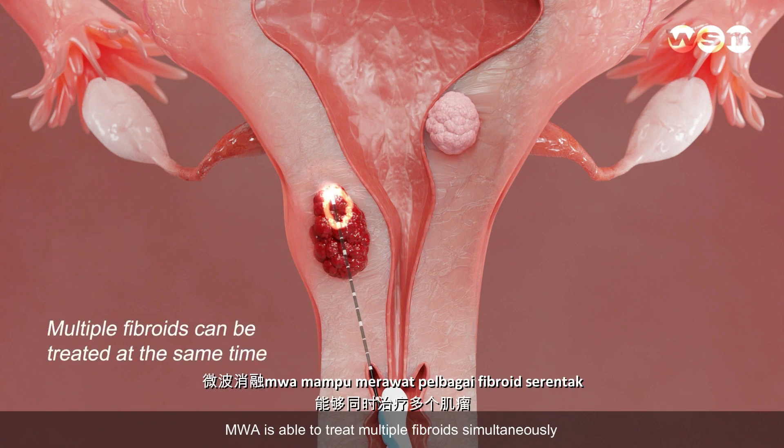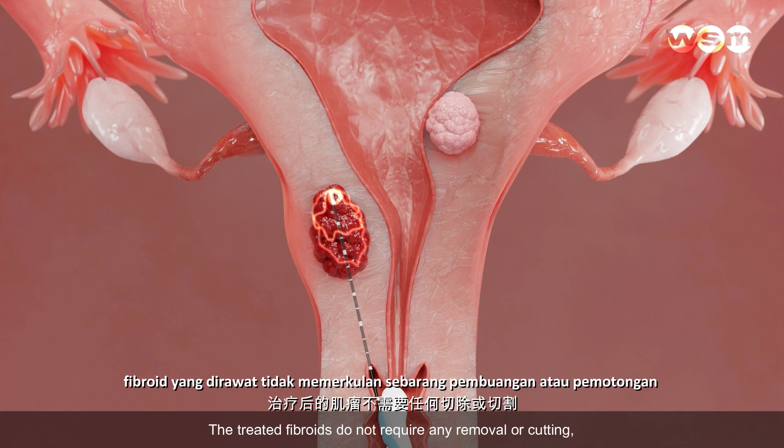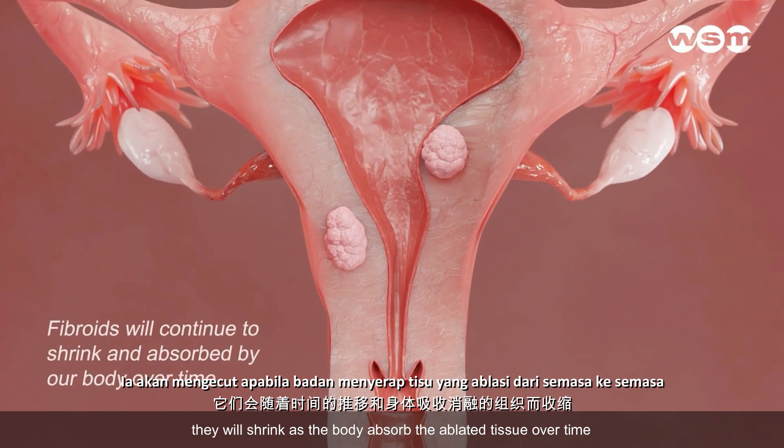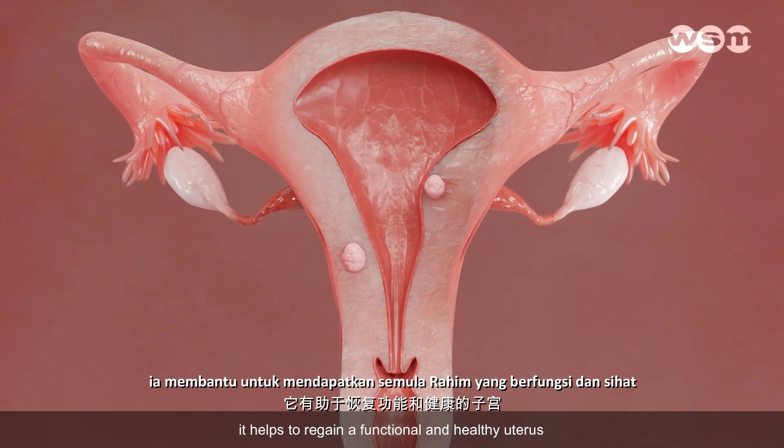MWA is able to treat multiple fibroids simultaneously. The treated fibroids do not require any removal or cutting — they will shrink as the body absorbs the ablated tissue over time, helping to regain a functional and healthy uterus.